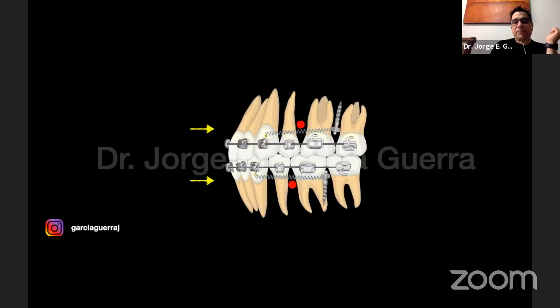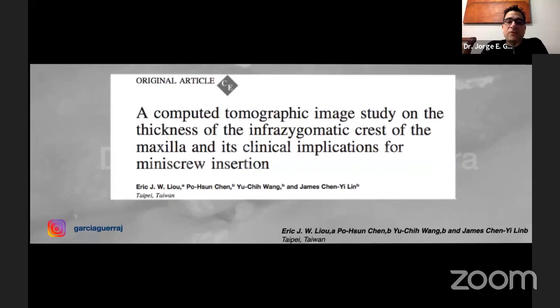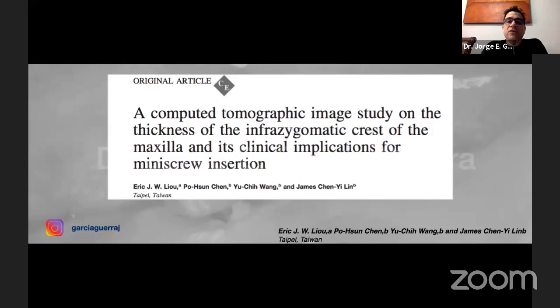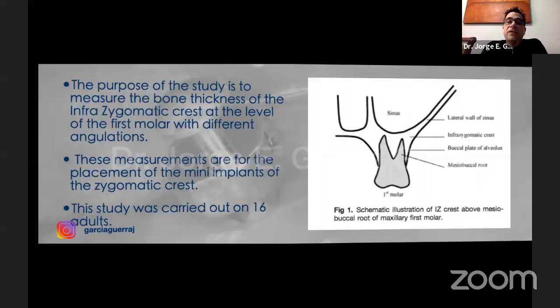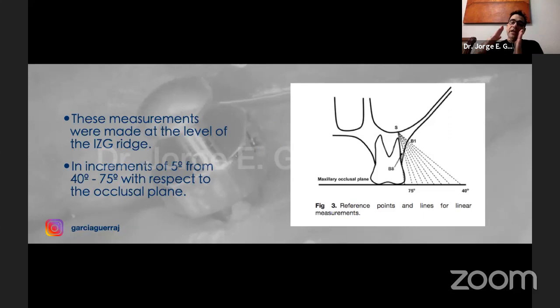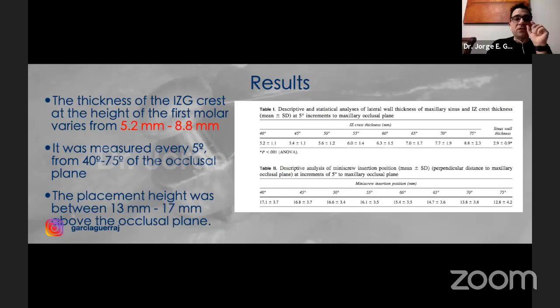That's an easy way. Now, we were seeing here some intraradicular space closure. What we're gonna see now is some infrazygomatic mini screws. And this is an article from Dr. Liu from Taiwan. And in this article, they wanted to measure what's the correct angulation or the correct position when we're doing an infrazygomatic crest mini screw, where we're gonna have the best bone thickness there. So in this article, they measured different insertion sites and they were using 5 degrees apart angulations, and they're gonna measure where we're gonna have the most thick cortical bone there. So the results they had, it's gonna be between 55 and 70 degrees angulation. It's gonna be the position where we're gonna have the best bone for the mini screw insertion, okay?